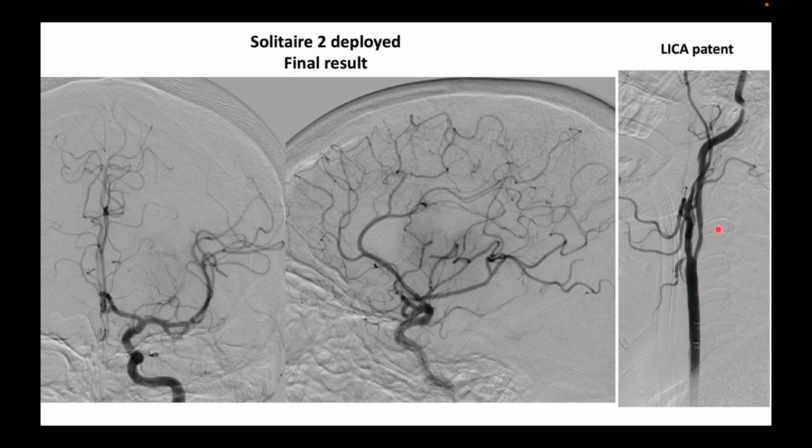So what we do is we tend to avoid giving patients antiplatelets during this cerebral intervention for the fear that it may convert to hemorrhagic transformation. So if it's holding well, we wait for 48 hours, we keep the patient in-house, and after 48 hours, we will bring the patient back and stent this carotid and put the patient on dual antiplatelet therapy.